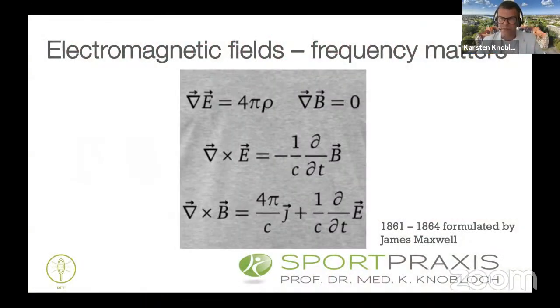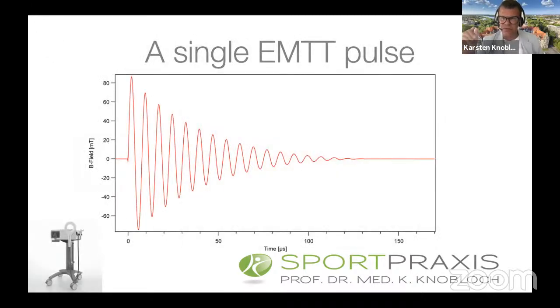So in electromagnetic fields, everything comes down to Maxwell's formula, where frequency plays a major role. And if you look physically, before my shockwave era, there were 10, 15 years of shockwave physics discussions on where to measure, how to measure, and so on. And the very same holds true now for magnetic fields.